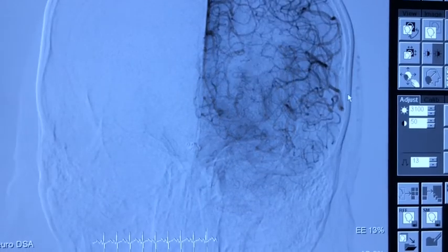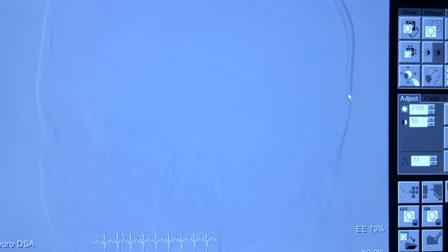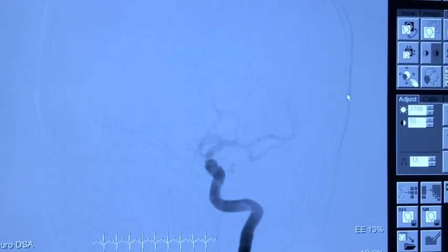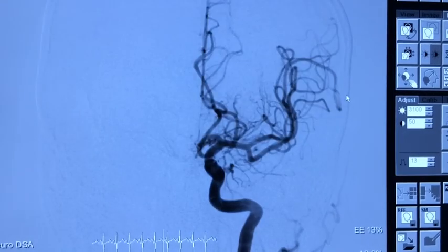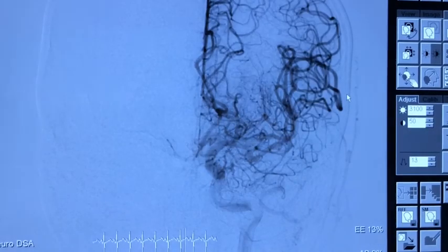This is how we perform balloon-assisted coiling to achieve complete occlusion of the aneurysm.